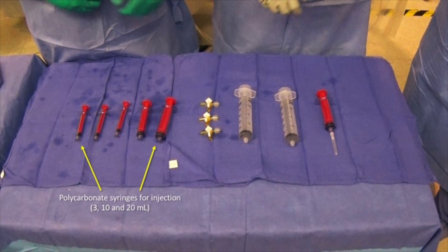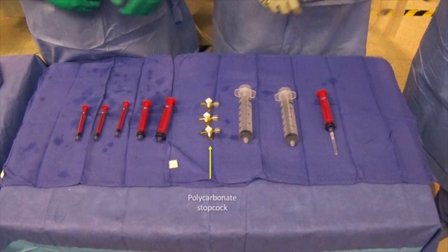For injection, we use 3 3-milliliter polycarbonate syringes, 1 10-milliliter polycarbonate syringe, and 1 20-milliliter polycarbonate syringe. 3 polycarbonate stopcocks. 2 60-milliliter syringes for mixing. And 1 20-milliliter polycarbonate syringe for drawing up Lipiodol.